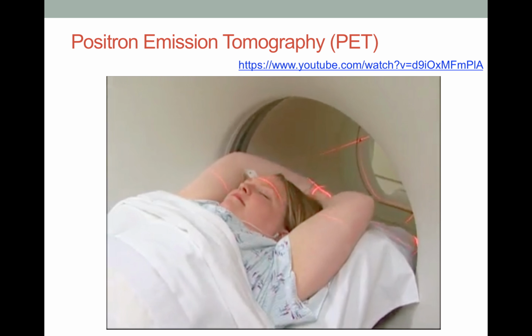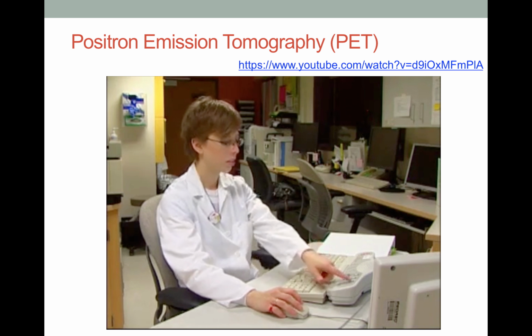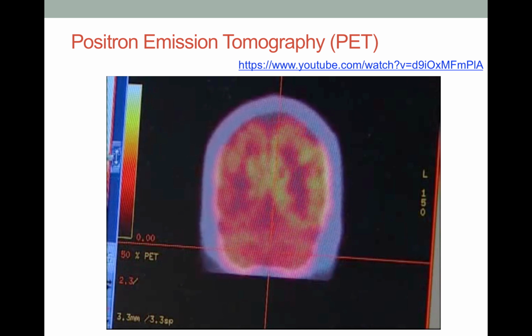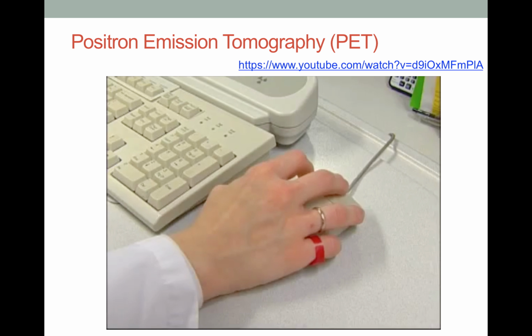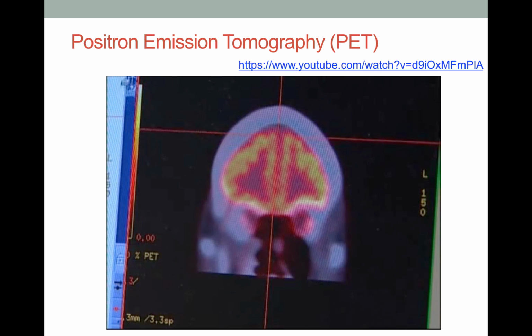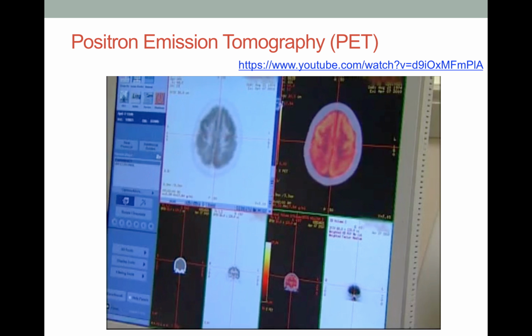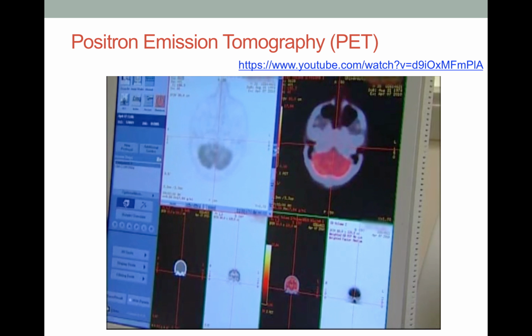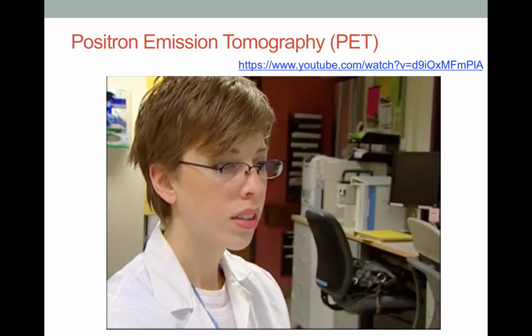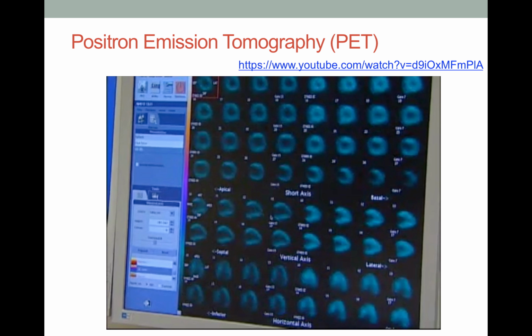If a muscle relaxant is planned for your exam, be sure you have someone to drive you home. The PET scan can be used in conjunction with CT, or computed tomography images, that allow physicians to pinpoint the exact location, size, and shape of the diseased tissue or tumor. PET scans are used most often to detect cancer and to show whether cancer treatments are working. PET scans of the brain are used to evaluate patients who have memory loss, seizure problems, or brain tumors. PET scans of the heart can be used to check blood flow to the heart muscle and help evaluate signs of heart disease.